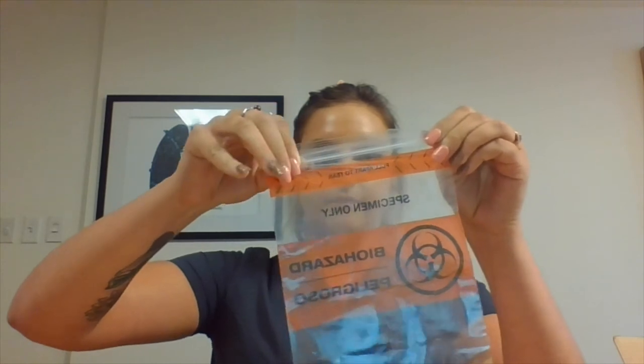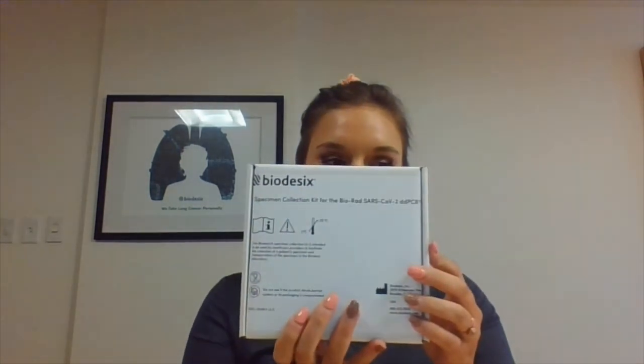Place the labeled tube in the biohazard bag. Place the biohazard bag inside the return shipment box along with the completed sample information card and close the box. Place the entire return box into the pre-labeled FedEx shipping envelope.